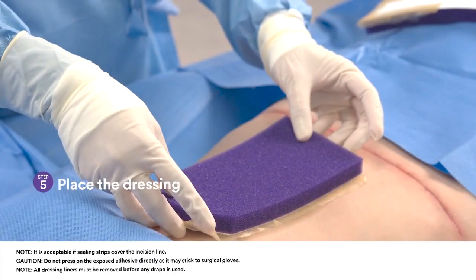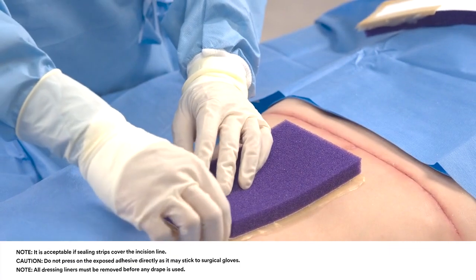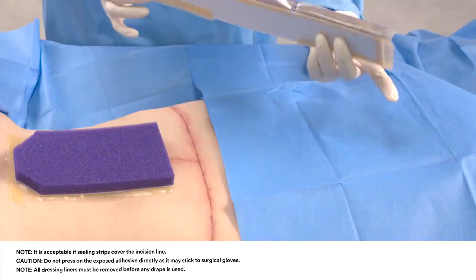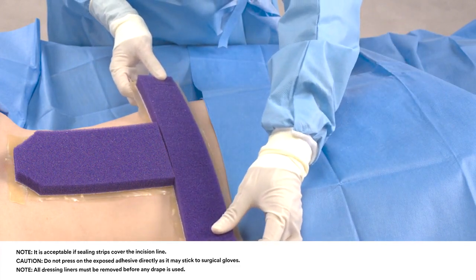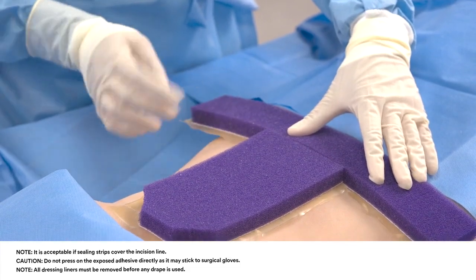With sealing strips applied, if used, position the foam dressing with the adhesive seal and white fabric facing down. Center the foam dressing over the incision or surgical closure. Ensure the adhesive seal and white fabric are facing down. Press down around the border of the foam to ensure adhesion to the skin.